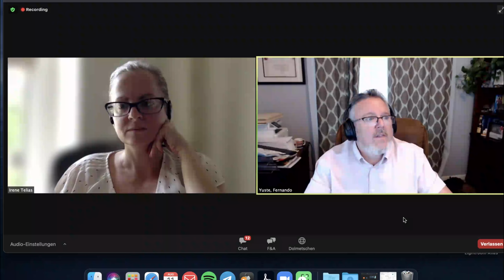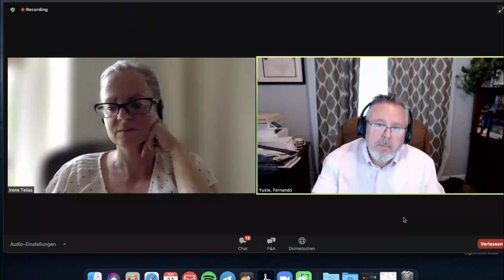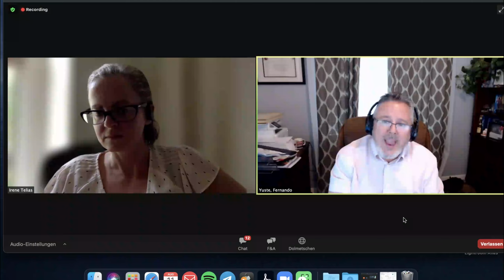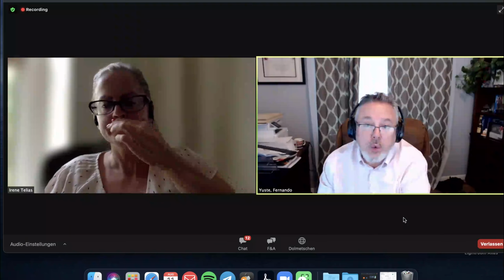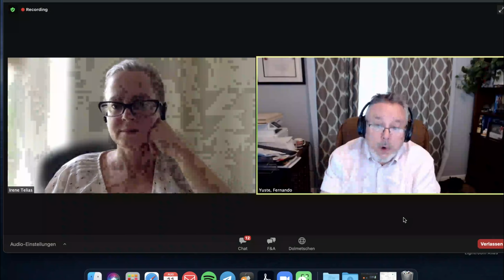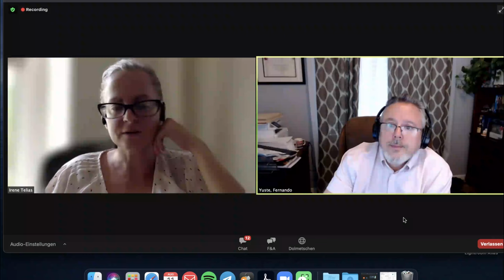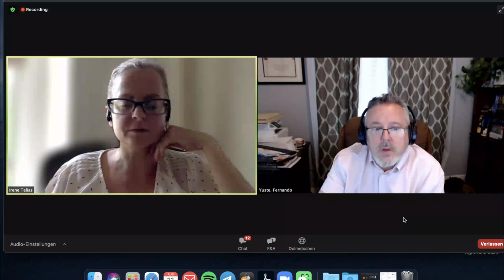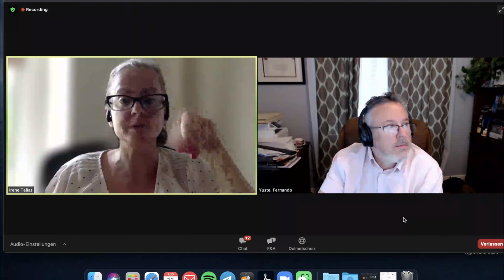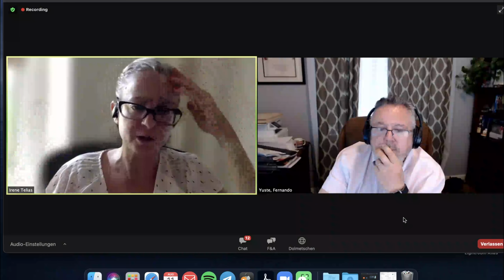He says that the presence of a known autopeep makes the P0.1 underappreciate the drive, since the effort first needs to overcome the level of autopeep in order to be sensed at the site of the measurement. Yeah, so that's a very, very important question. There are several caveats about both P0.1 and POCC. I didn't go into much detail so that people can actually use them at the bedside, because if not, people get confused with too much information.